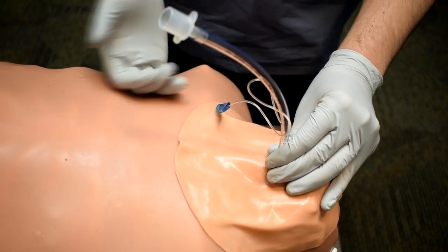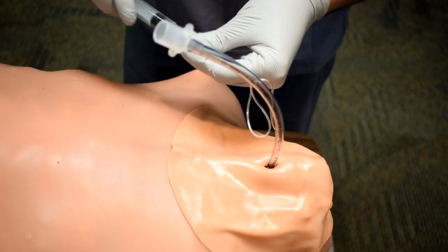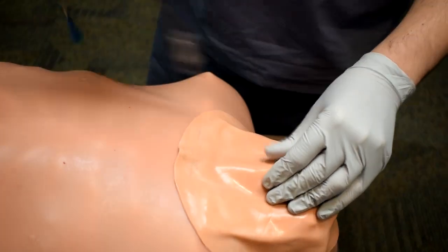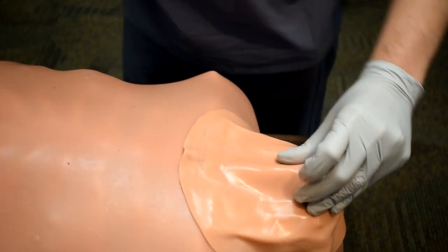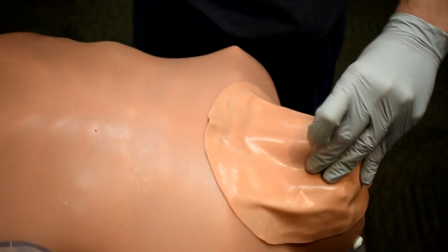emergency airway. As another option, you can also use a bougie catheter. So I'm going to deflate this and just show you another optional technique here. I'm going to take this ET tube out. So at this point, I have already punctured the cricothyroid membrane. I feel that it's open.